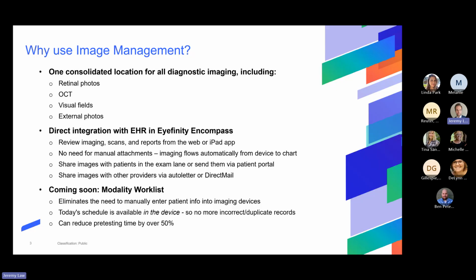And I'm sure all of you have encountered this experience where you're looking for a patient in the device and you realize, actually, I have two or even three records of that same patient, because when I or my staff were manually entering the patient's information, maybe we messed up their date of birth or we spelled their name wrong or something like that.